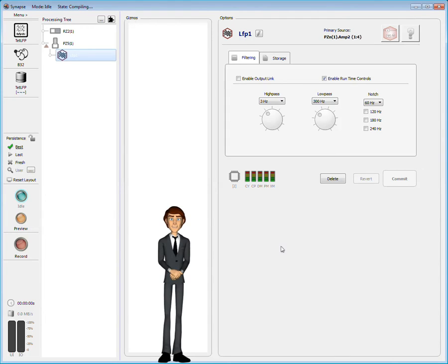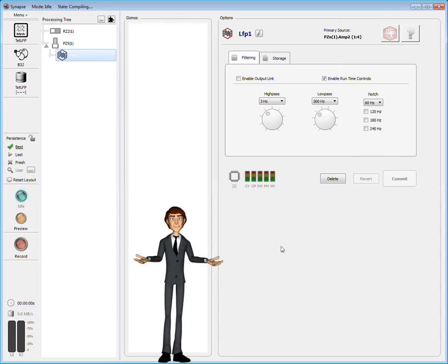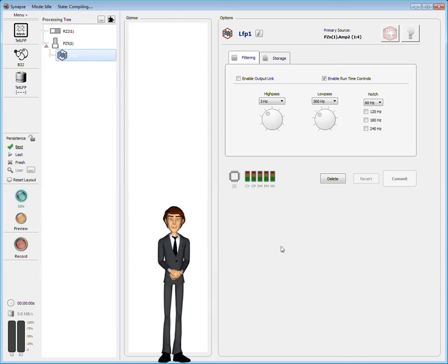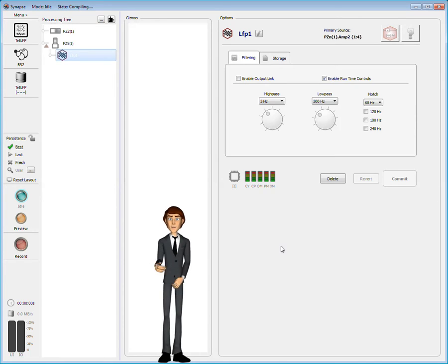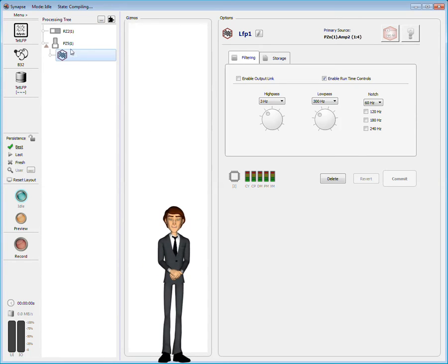However, I didn't enable the LFP gizmos optional output, so no gizmos can be added here. To find the gizmo for TetRoad sorting, I must select the source of the TetRoad data, the PZ5.